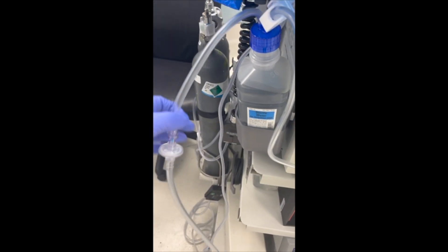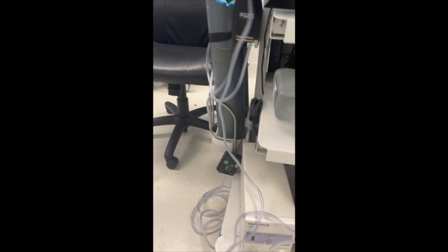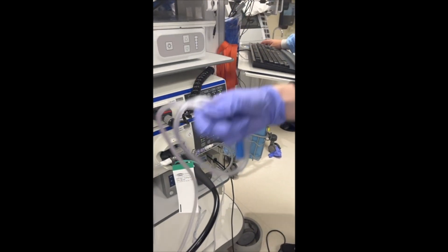The blue tip of the tubing connects to the scope through the irrigation pump. The third piece of tubing with a round end connects to the CO2. Finally, connect the suction tubing.